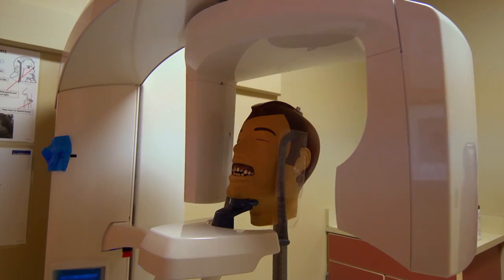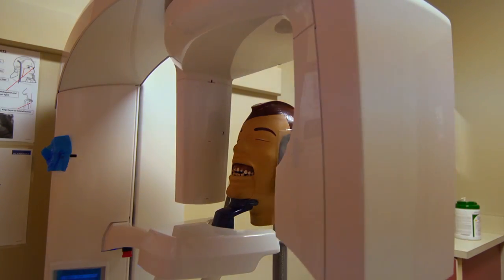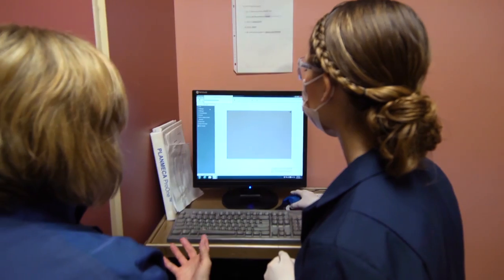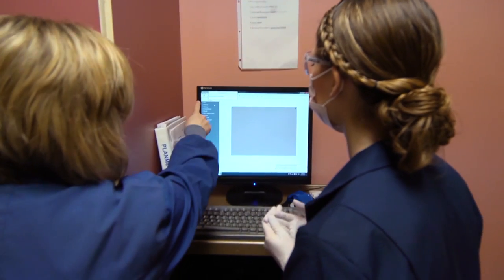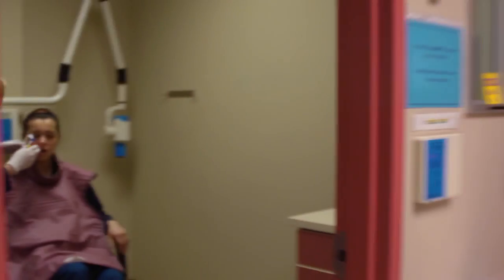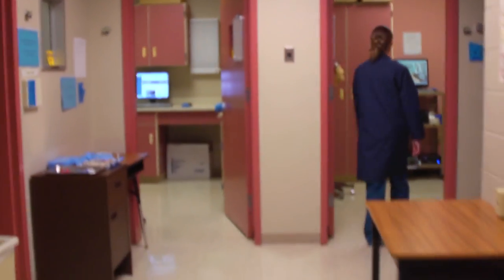Dental radiographs are used to help assess the oral health of patients, and this lab allows dental hygiene students to become competent in this area. Thanks so much for joining me in Dental Radiology Lab.